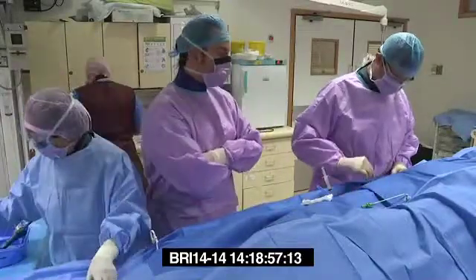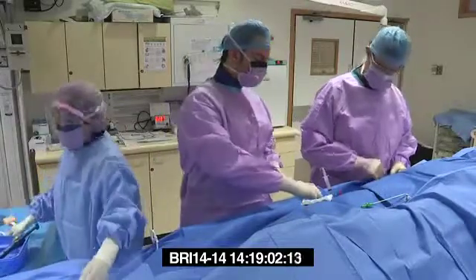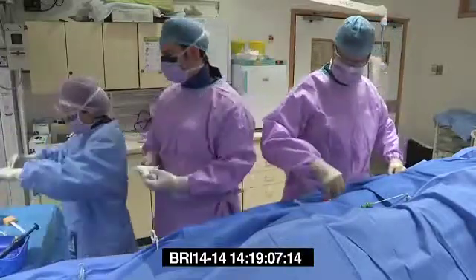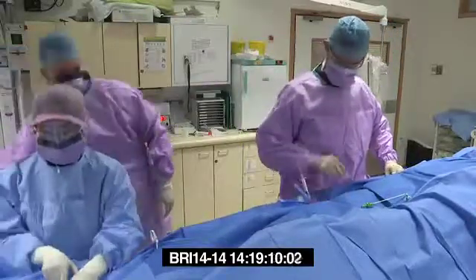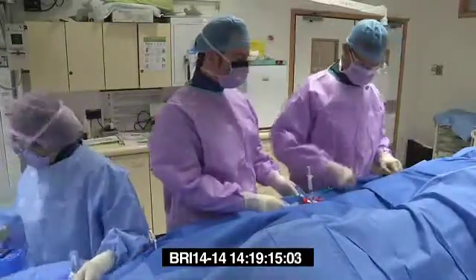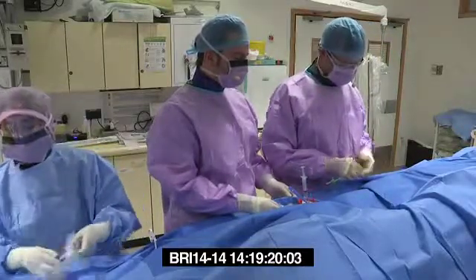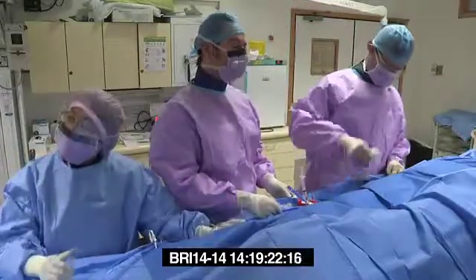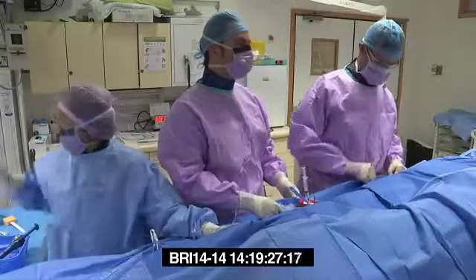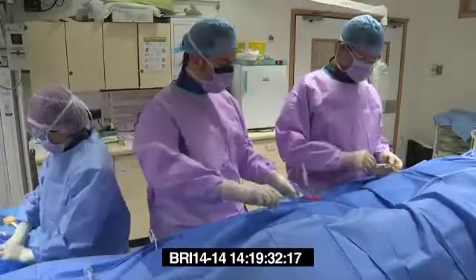Okay, let's take a right 4 diagnostic. We'll take a left 3-5. Left 3-5 diagnostic as well, and then we'll think. Have a wet swab, please. Thanks. So we've got dual antiplatelets on board, and we'll just hold fire on the bivalirudin until we got. Radial cocktails in.